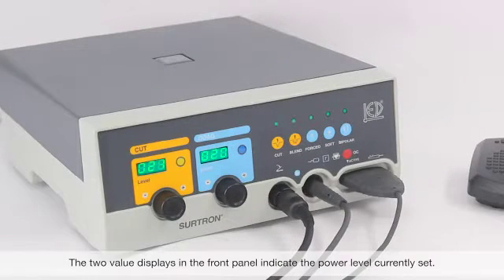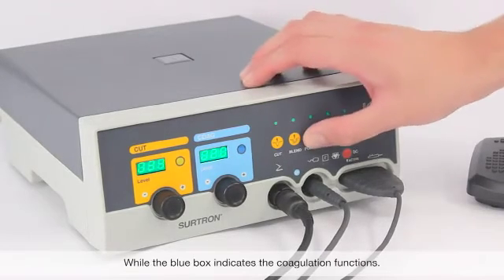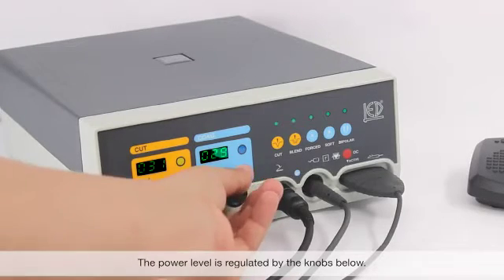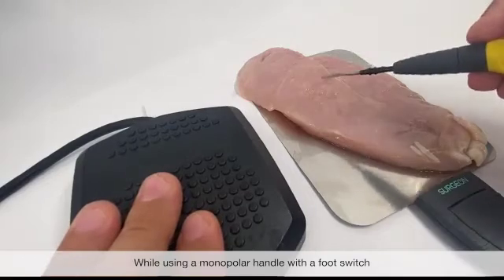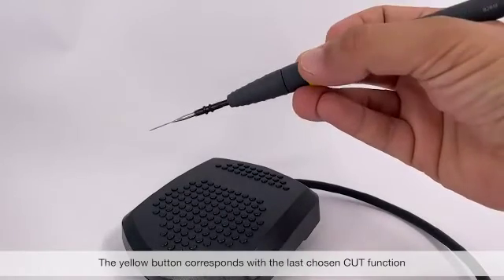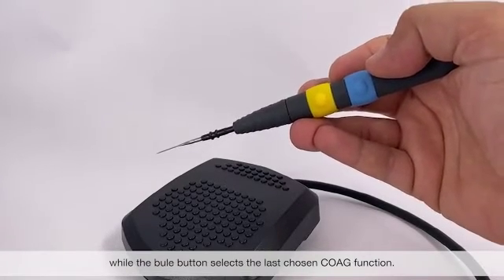The two value displays in the front of the panel indicate the power level currently set. The yellow box corresponds to the cut functions, while the blue box indicates the coagulation functions. The power level is regulated by the knobs below. While using a monopolar handle with a foot switch, you will be able to switch between cut and coag functions by pressing the yellow and blue buttons. The yellow button corresponds with the last chosen cut function, while the blue button selects the last chosen coag function.